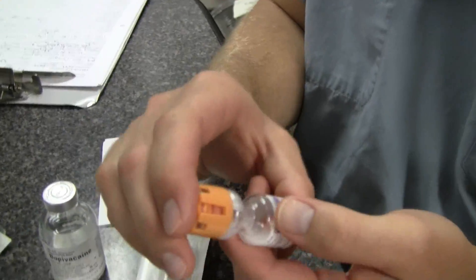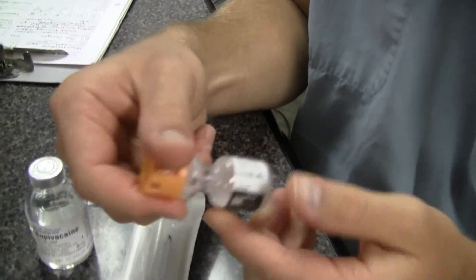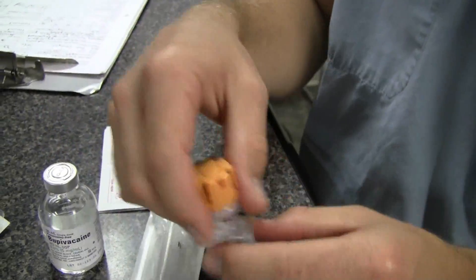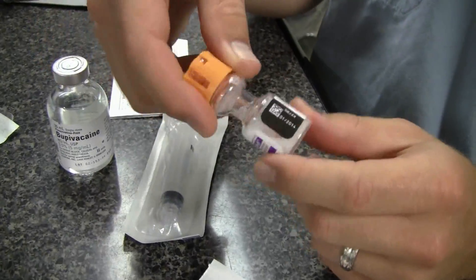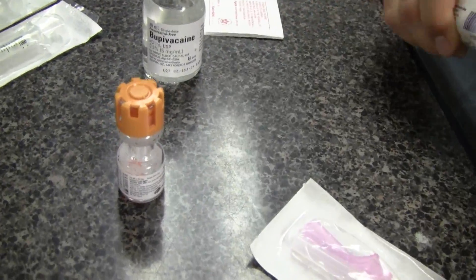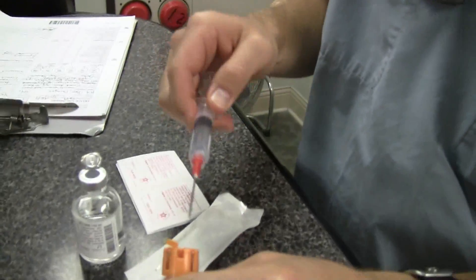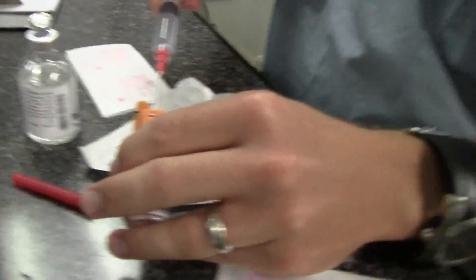We're mixing up the Solu-Medrol with 2cc's of diluent and we're going to draw off 40 milligrams worth — that's 0.6cc of this one. Just going to draw 0.6 of that.